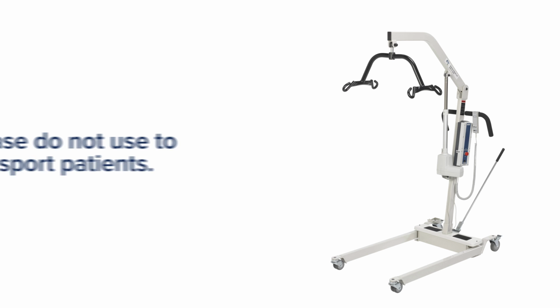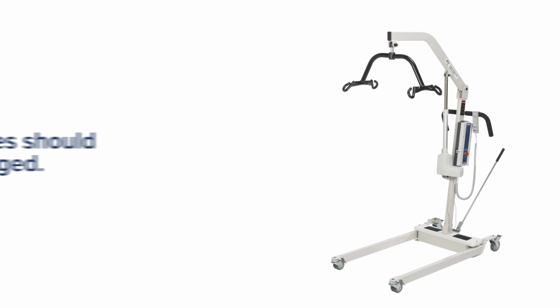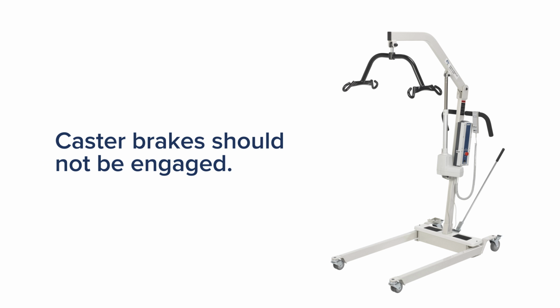Let's review some safety tips for operating the lift. The lift is used to transfer patients from bed to wheelchair or commode. Please do not use to transport patients. Always remember, when lifting a patient, the base legs must be in the most widely open position, and the caster brakes are not engaged. This will prevent tipping.